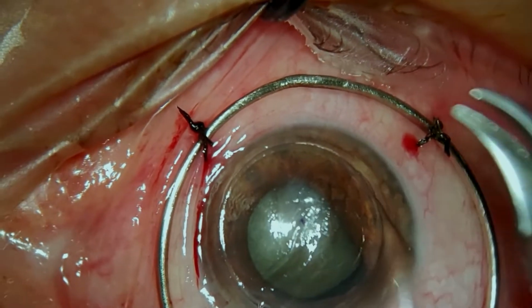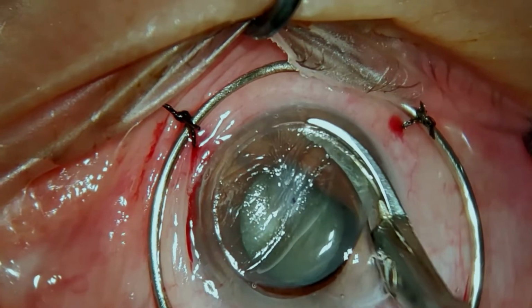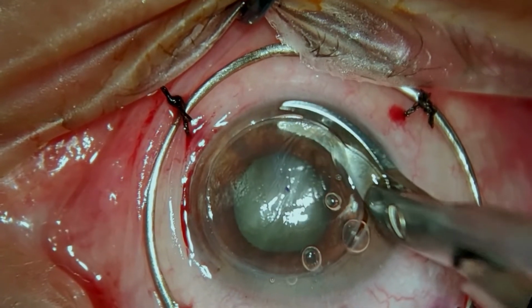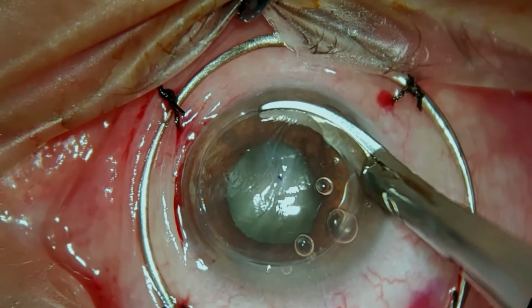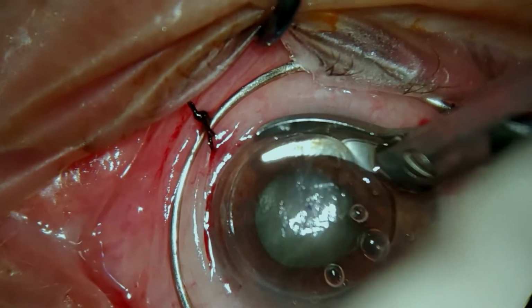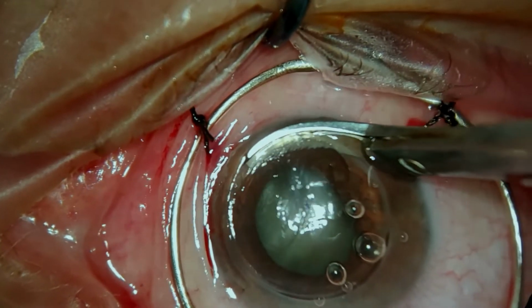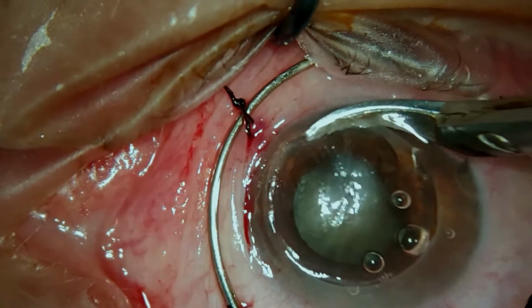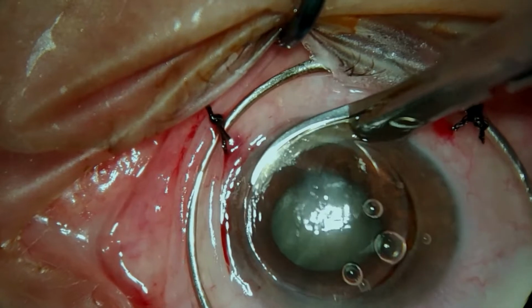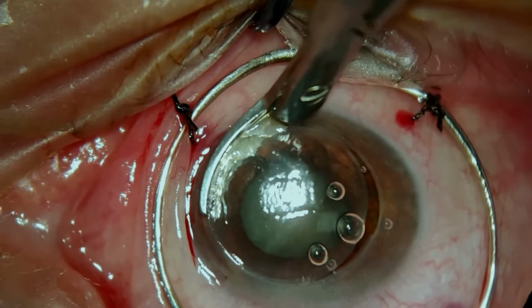when the cornea is clear like this, it's pretty straightforward not to engage the iris or damage it or damage the lens, and also when there's no pressure. This case is one of the friendlier ones. So as I was saying, it's very important to have vertical margins to your cut. This is why you mustn't rush this step. You should enter with your scissors horizontally, and then as you're starting to find the groove, hold them vertically so that the trephination site has vertical margins.